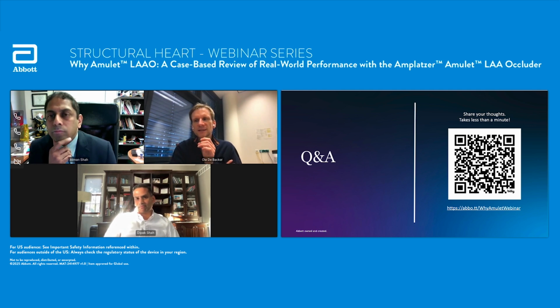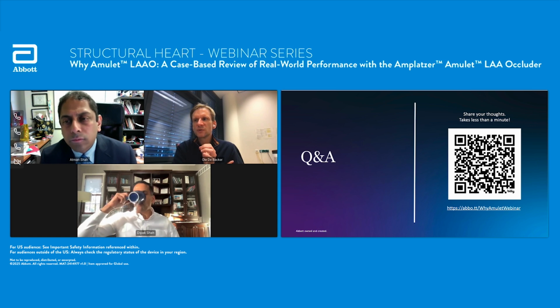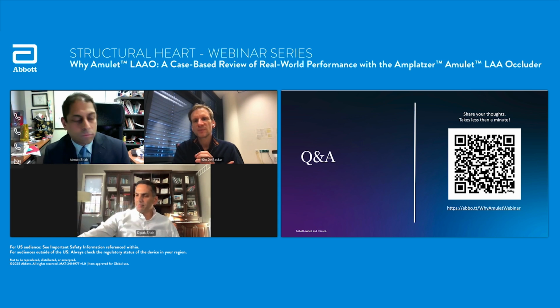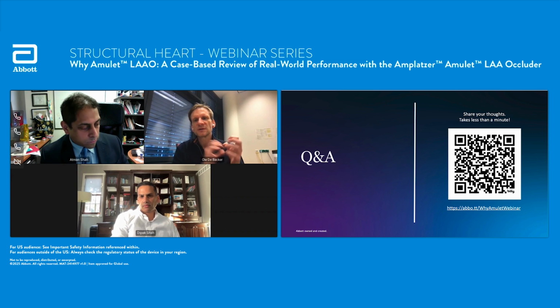I mean, look, that's the whole point. You see how we deploy these devices. It's really slow, like slow motion almost. Nothing is quick. So what we do is you make the ball. When you have the ball shape, that means if you have just the single ball, the barbs, the anchoring parts, are not working yet. So that's the moment for me to bring the coaxiality right, to do some more counterclockwise or anterior torque, yes or no. So when I have the ball, that's the moment to get my coaxiality right.